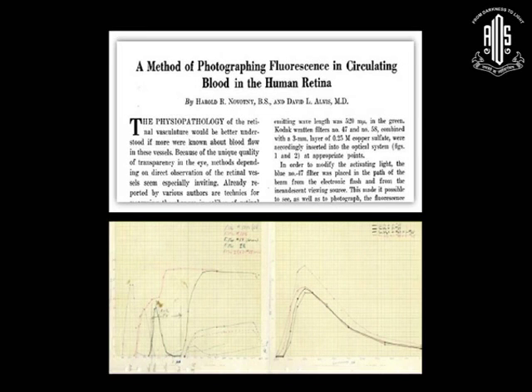And this should be the most inspiring paper for all of us, because for half a century we have been using this technique by Novotny and Alvis, and these are the hand-drawn diagrams of the emission and absorption curves of sodium fluorescein. So can we do fluorescein angiography or angioscopy on a smartphone? That was the next thing we had to think of.